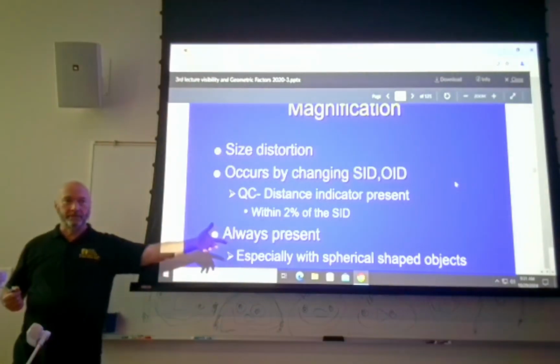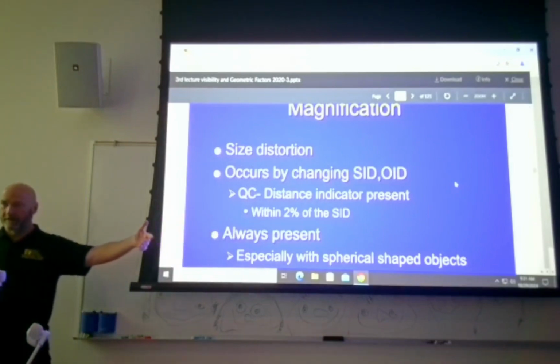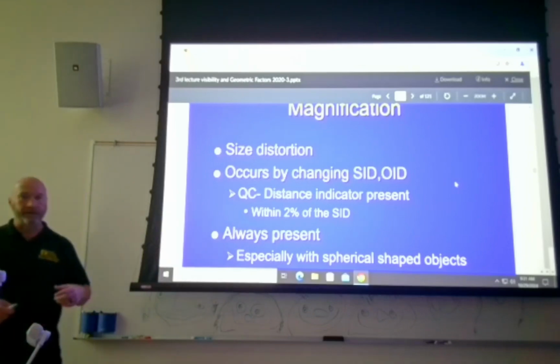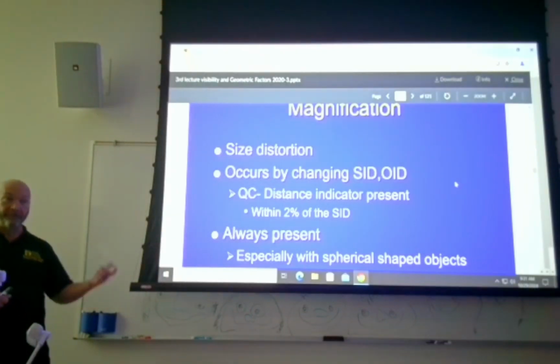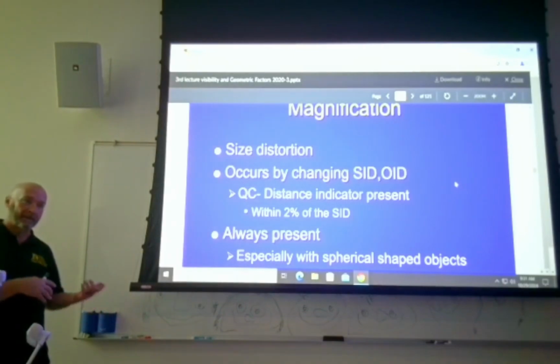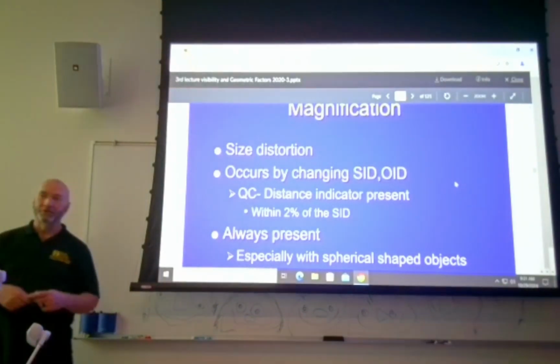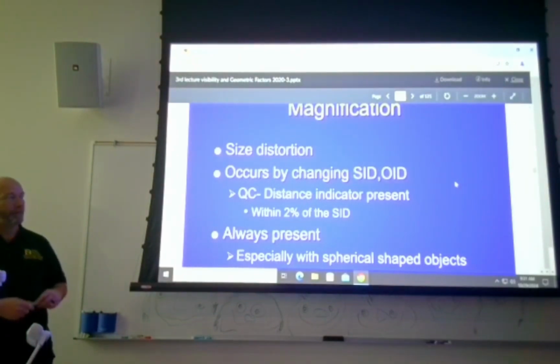Don't just let it go. It's kind of like your tape measures at home. You'll break the end of it off, let it come back in. Your quality control on that is that if it's broken off, somebody's going to have to take that collimator housing off and replace the tape measure, right? So don't just let it go. You make it work for other people.